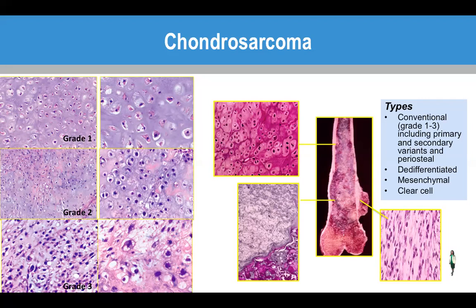So they really don't need to do a biopsy to confirm it. Usually pathologists get a resection specimen. So our job is to decide the tumor type, tumor grade, and the tumor margin. In this case, you can see the sample is very heterogeneous. Over here, you have a transition from benign cartilage to some low-grade cartilage.